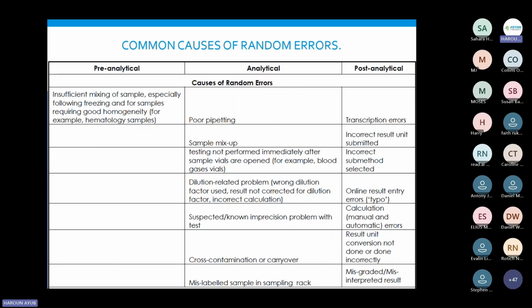Now, pre-analytical is how we were mixing. The other point that you might add here is reconstitution. Remember the case I told you, if you are doing tumor markers and chemistry, but tumor markers has an instruction of using 3 ml, but you are so invested in the lab that particular day and you forgot chemistry was 5 ml, or you did not check the IFU and you used 3 ml on both, you'll get that kind of indication. So when you check your results, you're finding that everything is positively biased because you reconstituted wrongly.